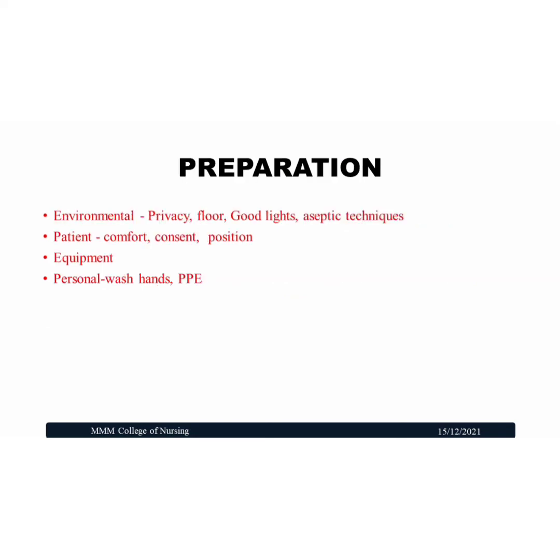Next, let's see the preparation. This is the common preparation for any procedure, with these 4 domains. First is environmental preparation: privacy, which is most important for any patient, good lighting, aseptic techniques, comforting the patient, and consent from the patient and guardian. Make sure the position and equipment are ready, as I told. Personal preparation is washing the hands and wearing PPE, personal protective equipment.